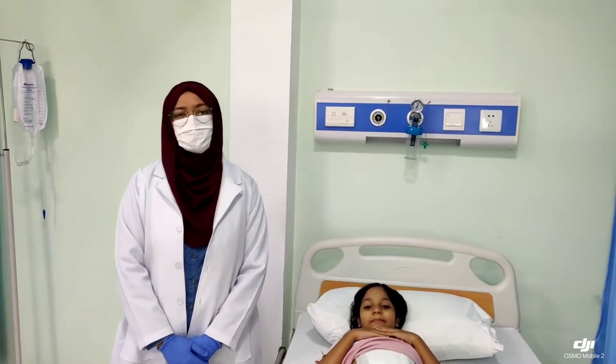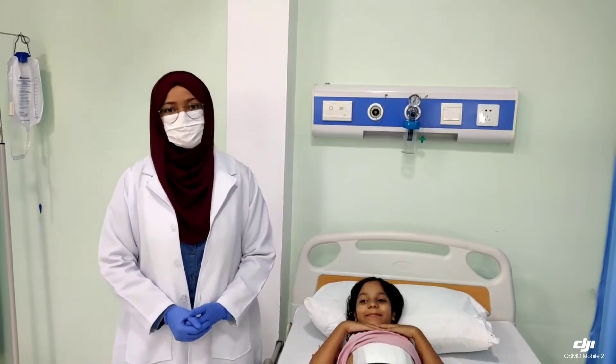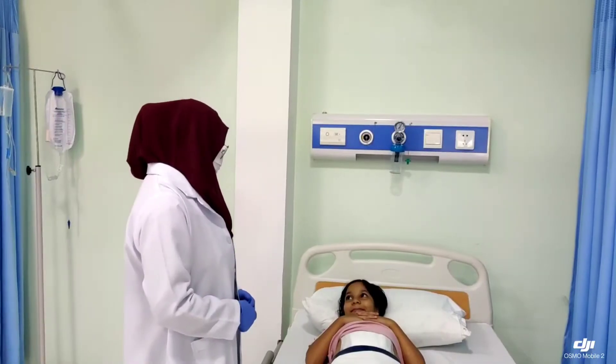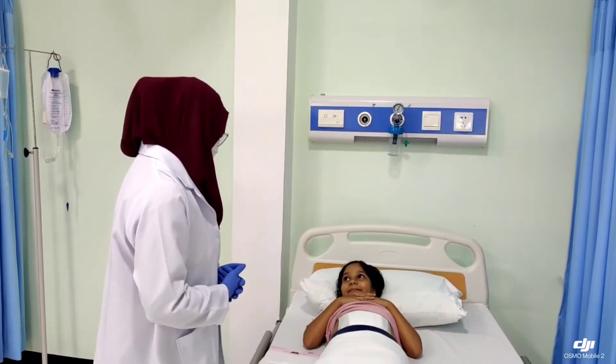Hello, I'm Lam Havla from Group 1 and today I'm going to show you how you can apply an abdominal binder. I'm your nurse today and I'm going to help you to apply an abdominal binder. Is that okay?